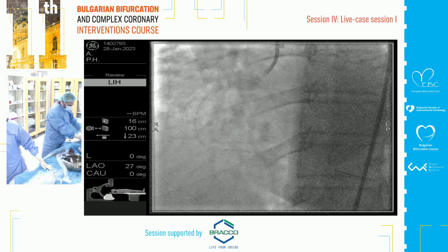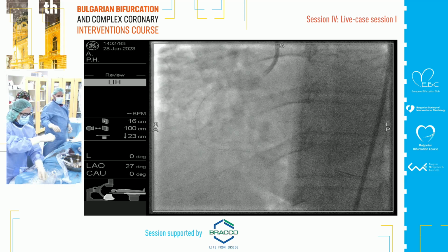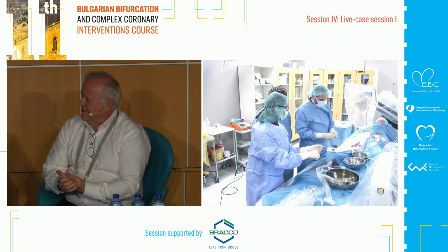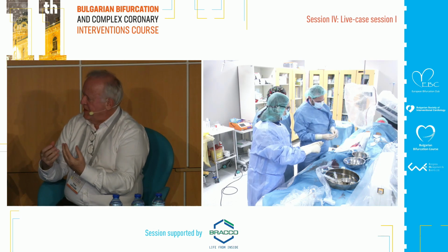So the stent was 3.0 by 12, yes? So why use a high pressure balloon? Sorry, a non-compliant balloon, why? Because they gave me this one, but maybe it is also semi-compliant. In my cath lab, I usually use semi-compliant. He's Italian. It is a soft lesion. He is used to say the truth, it's not depending on the lesion.